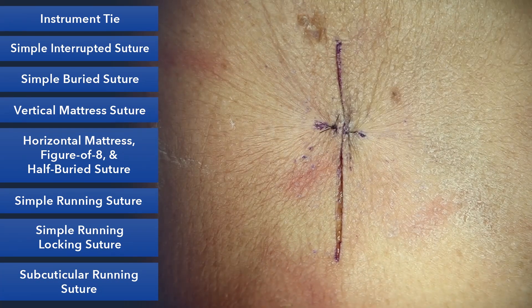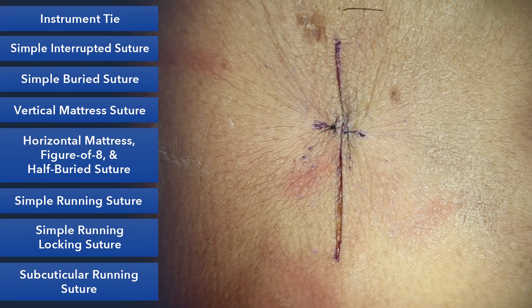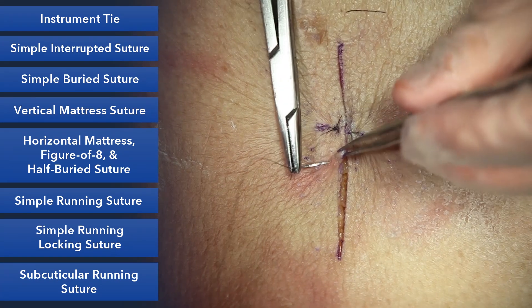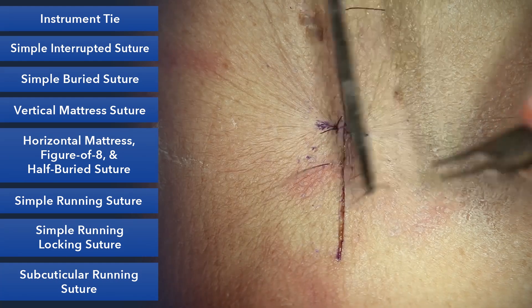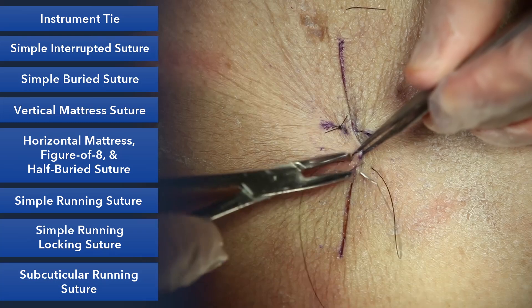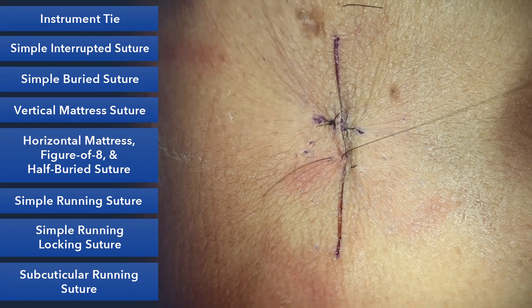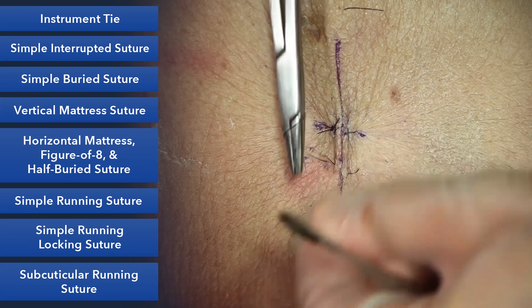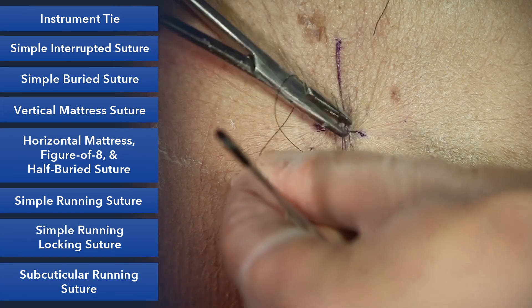Let me show you that one more time. It's a vertical mattress suture — far, far, near, near — and as you tie it down, decide how much tension you need to evert your skin edges and hold things together.